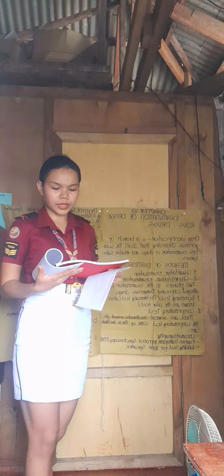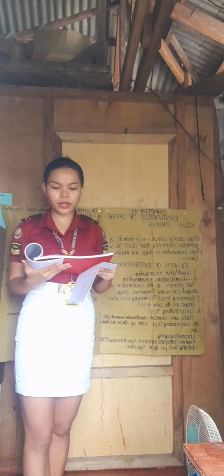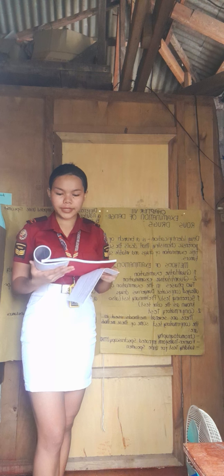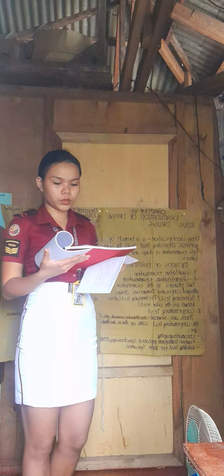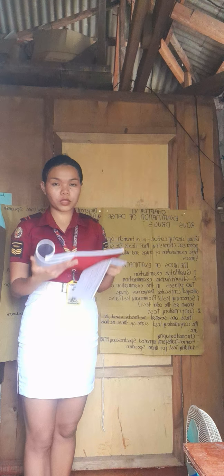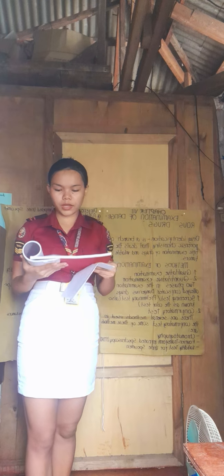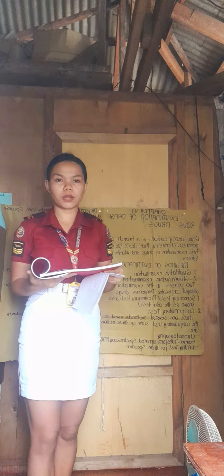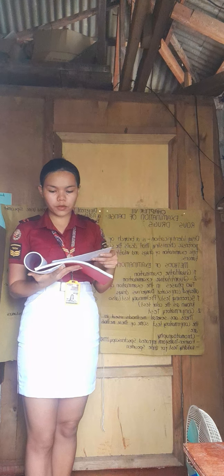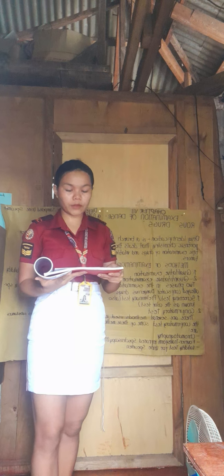Chromatography. It is the process of separating mixtures and comparing the migration of each component with standard. Some chromatographic techniques include gas chromatography, thin layer chromatography, high pressure liquid chromatography. So examples of chromatography are food testing, drug testing, and forensic testing.